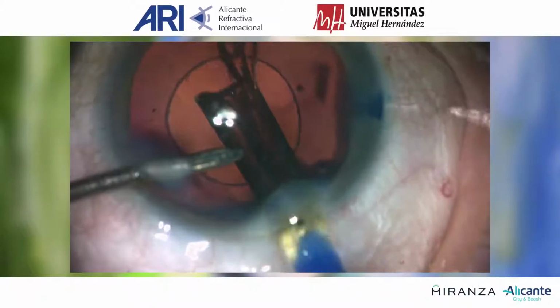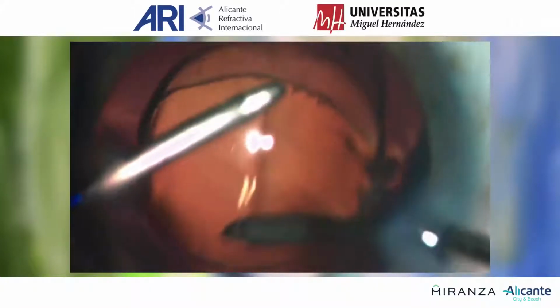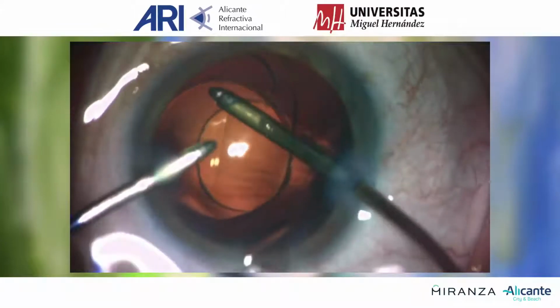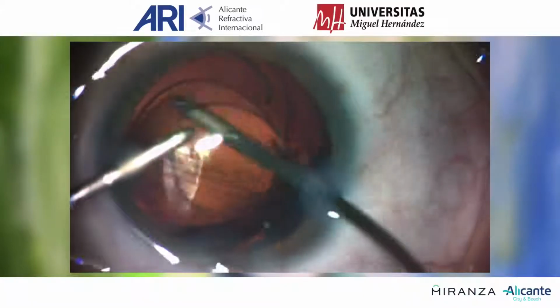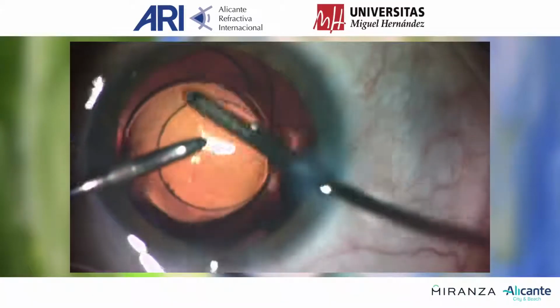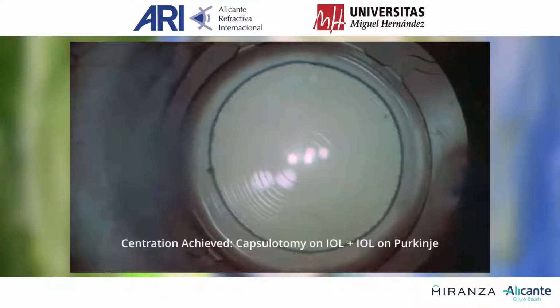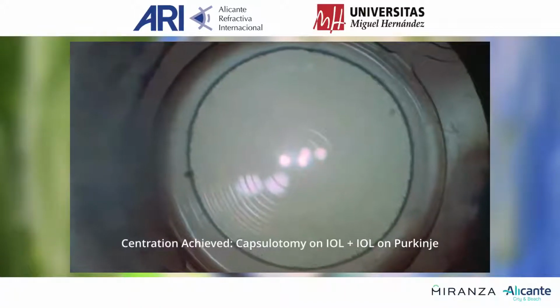The trifocal intraocular lens is being injected and OVD irrigated from behind its optic. The capsulotomy is perfectly centered over the trifocal lens optic at the conclusion of surgery.